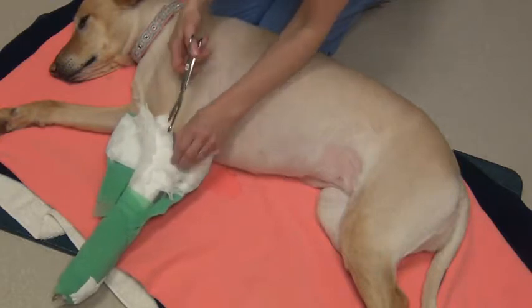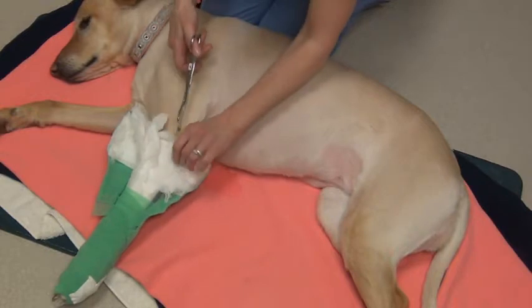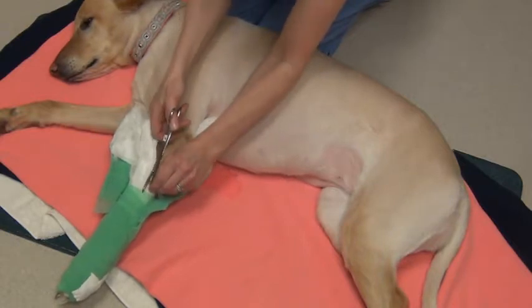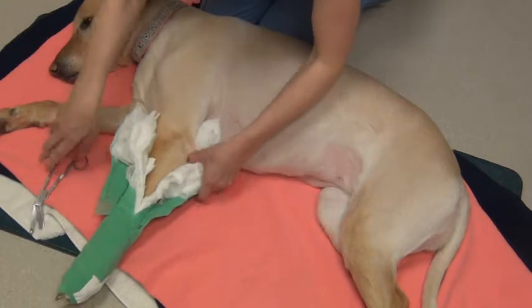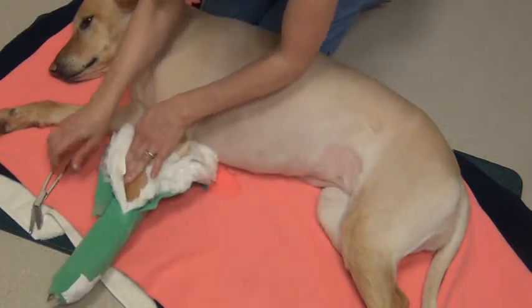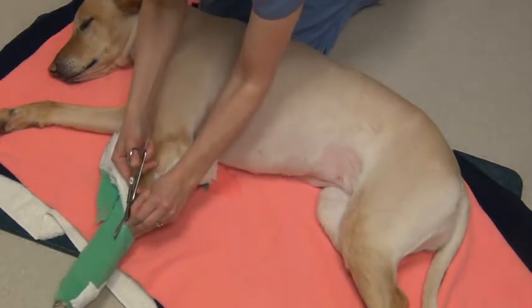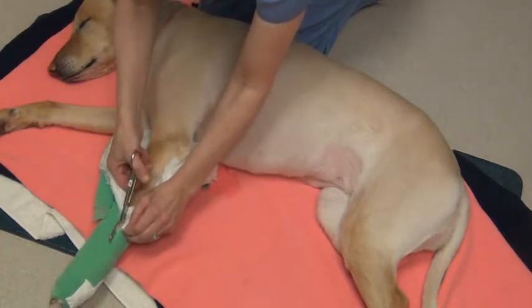Not only did I watch the video with Dr. Jody, I did utilize my McKiernan's text to gain knowledge on bandaging before we put this on Daisy's leg today. So we're just taking it off little by little with our bandage scissors. Being a very good girl, this is a very thick bandage. Very sweet girl.